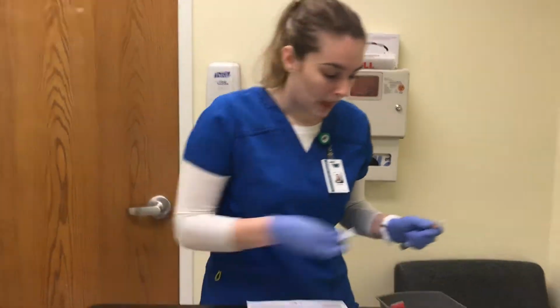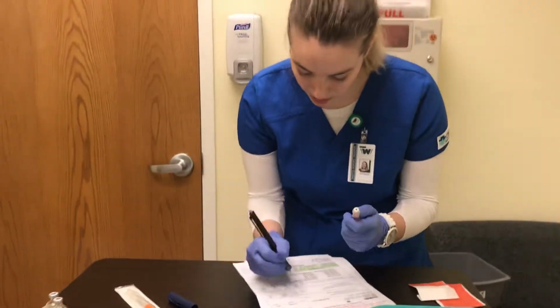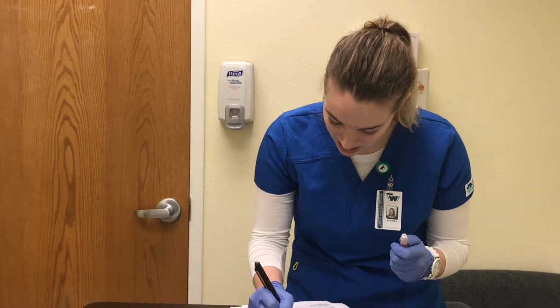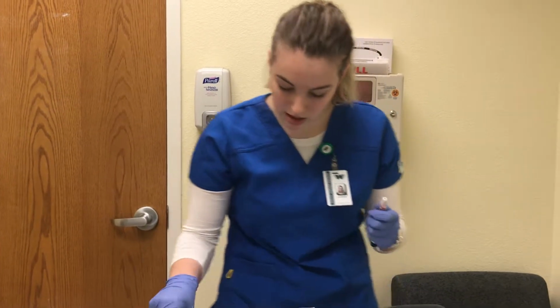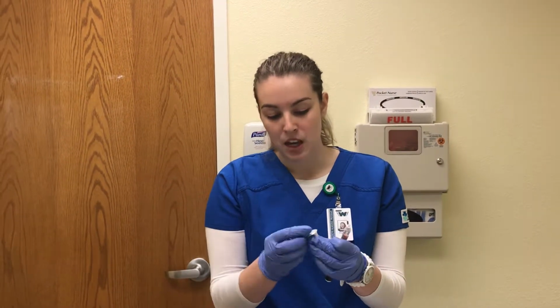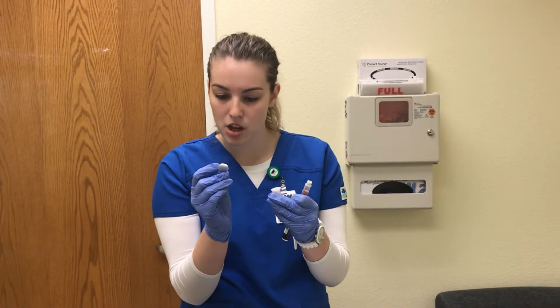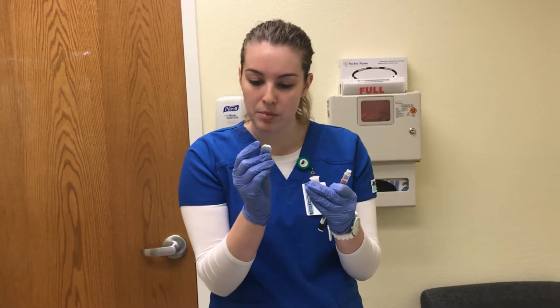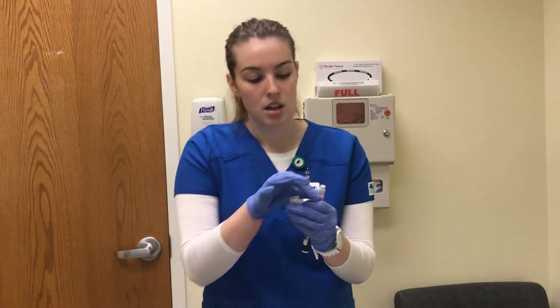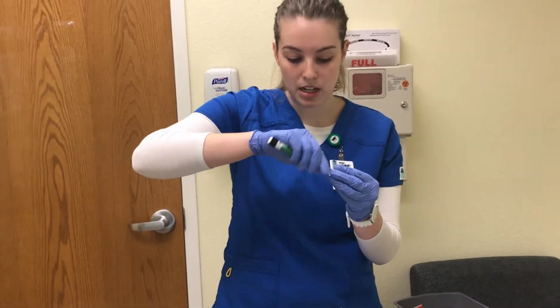okay, I'll let that dry. And as that dries, I'm just going to put their blood sugar. So it was 178, so I'm going to be giving 2 units. Okay, so now that that has dried, I'm just going to open this, make sure I have the correct needle. 0.3 millimeters by 5 millimeters, 31 gauge by 3/16. That sounds right. Okay. So now I will just twist my pen onto my needle.